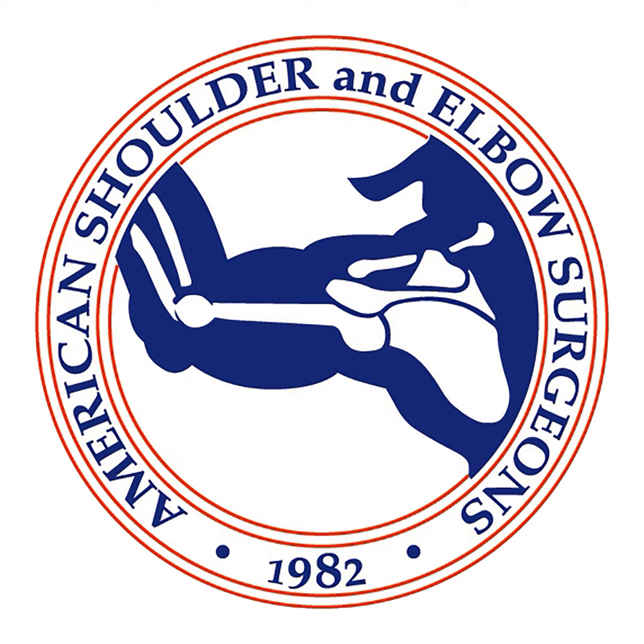So I've gone to probably in the last 3 or 4 years, adding augmentation to any massive tear primary surgery where I'm worried about healing. So someone with advancing age who's over 70 or medical comorbidities like diabetes, high cholesterol, kidney disease, a smoker, or also in those tendinopathy ones like Peter mentioned, where when you look at the preoperative MRI, the tendon looks kind of thin and maybe they have some grade 2 atrophy and you're a little bit worried about the healing potential. In those cases, I don't hesitate to add one and probably do once a week.